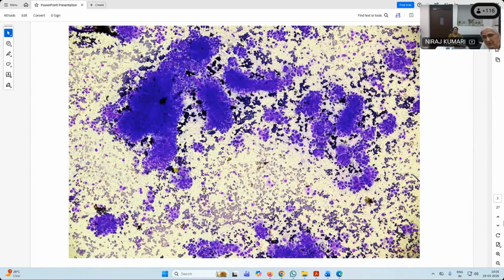Yes, so it is not follicle. Actually, these are the cross sections of the papillae. So you can see here a central fibrovascular core kind of structure. Okay, some spindle cells with some connective tissue matrix. So this is the core, and you have cells arranged around that core. So these are basically papillary structures or papilloid structures. Again, this is the cut surface of that papillae, where you can see a central connective tissue, which must be the connective tissue of the vessel, and the cells arranged around it. So these are papillary tufts of papillae and papillary structures.